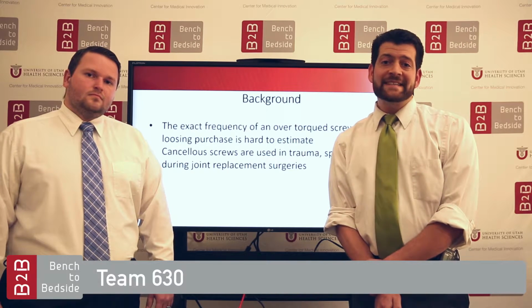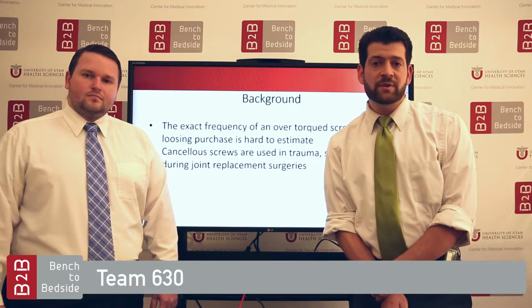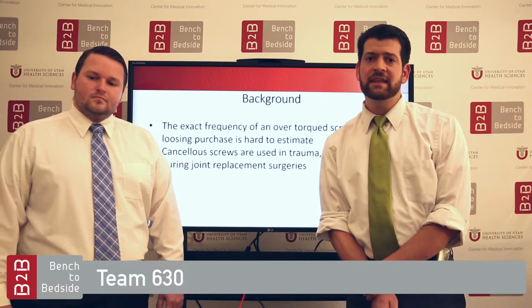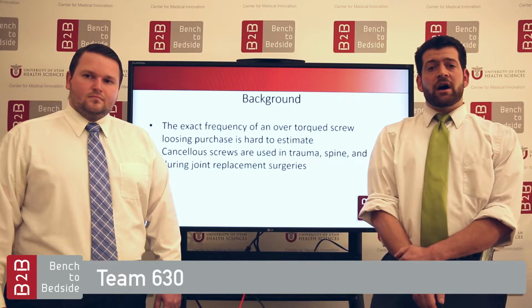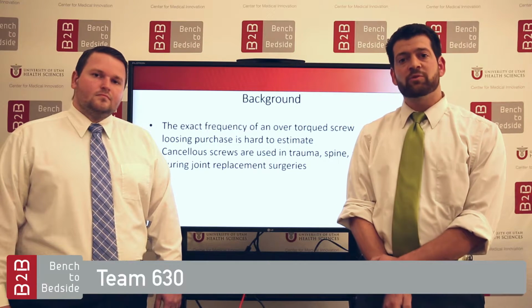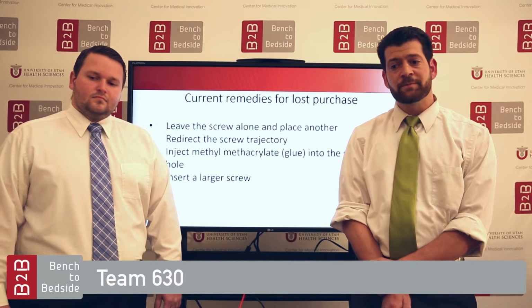It's hard to know exactly how often screws lose purchase during orthopedic surgeries, but in my experience and with discussion with orthopedic surgeons, I know it's more frequently than once in 100 and less frequently than 1 in 10. Cancellous screws are used very frequently in orthopedic surgery. They're seen in trauma surgeries, in joint replacement surgeries, and for pedicle screws in spine surgery.